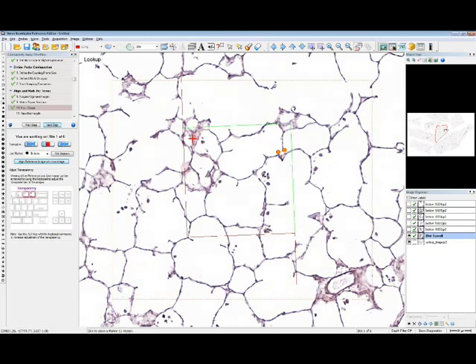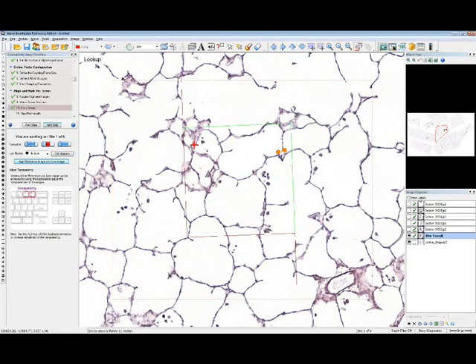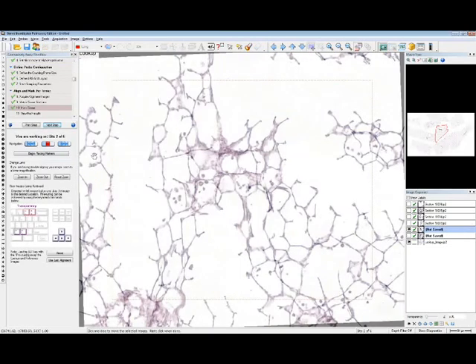Here, actually, we're going to count in one direction. We're counting from lookup to reference. So actually, in here, we're seeing fewer bridges from lookup to reference. So we're not going to count those. We're going to stop here. So that's it for this counting frame. So we'll go to the next dissector.